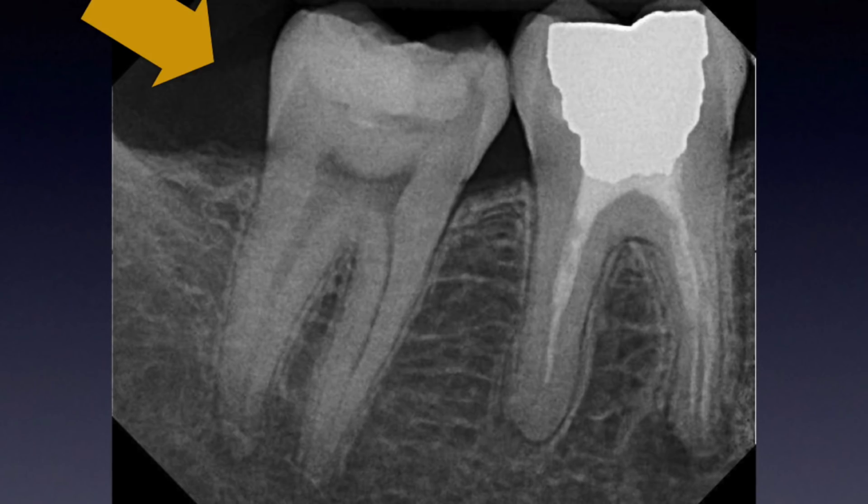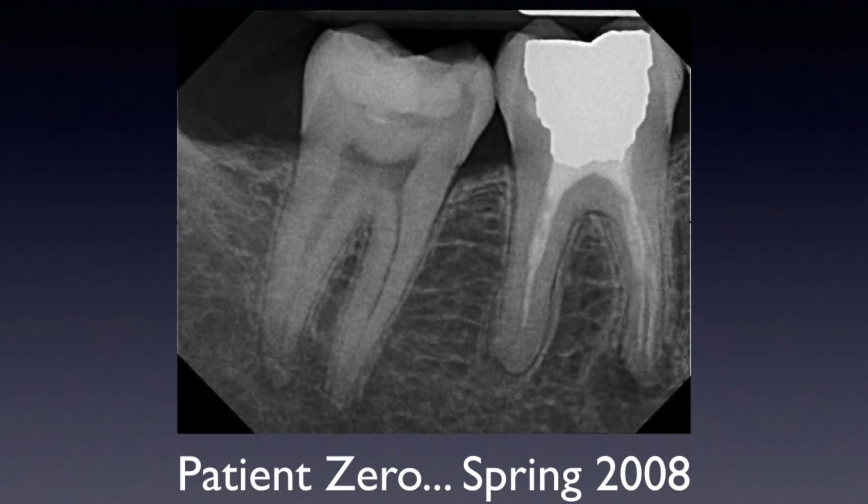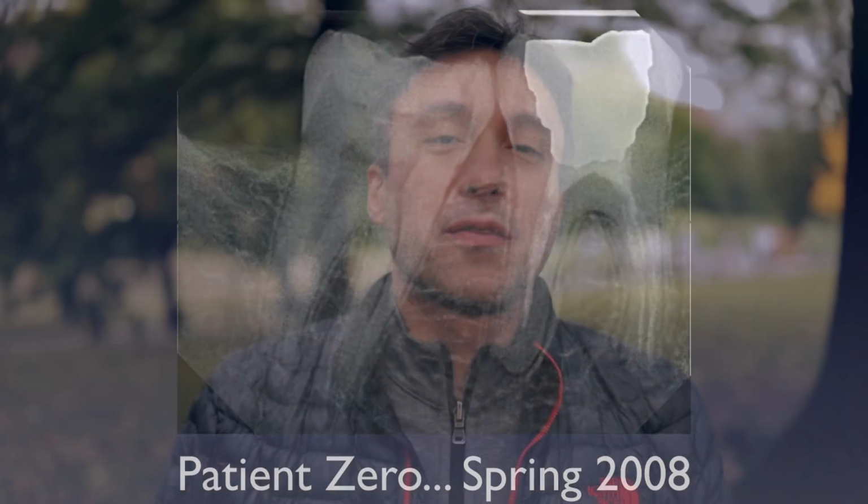Now, one of the reasons that I wanted to discuss this case with you is because this is actually the very first clinical case done using hydraulic condensation and bioceramics here in North America. How do I know that? Well, I know it because I did the case myself, and it's the day after the FDA approval of bioceramics in the US. And of course, I had done the testing on extracted teeth for months leading up to it and worked with the scientists and the manufacturer before to validate this technique.